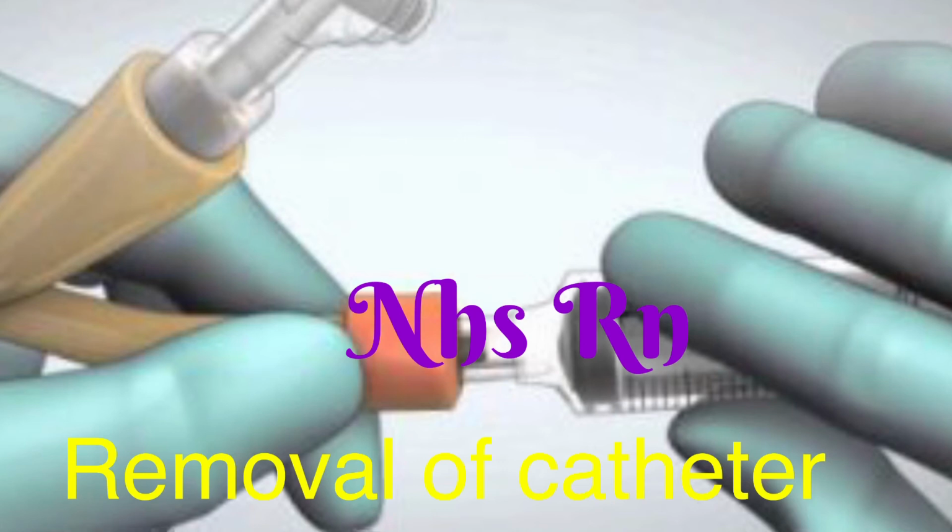slowly remove it. Yeah, then don't forget, all things, the catheter bag, syringe, everything together, you need to put in the clinical waste bag. Okay, so you need to make sure that all things together are put into the clinical waste bag, and then gel your hand, cover the patient. Don't forget that, that's the important thing. Cover the patient, gel your hand.